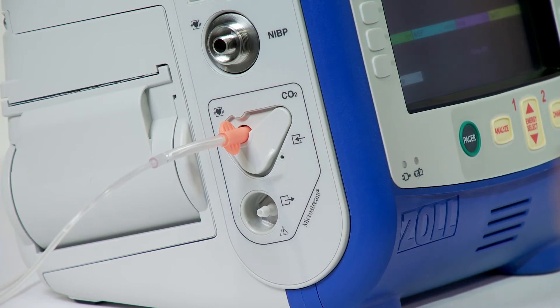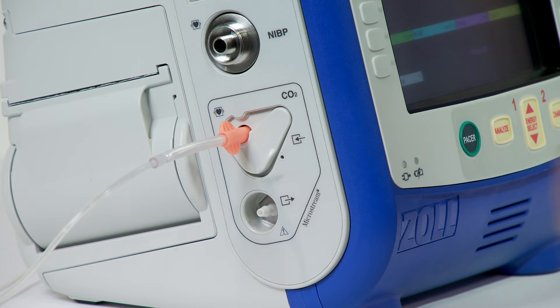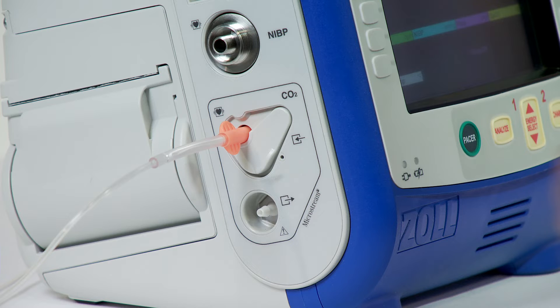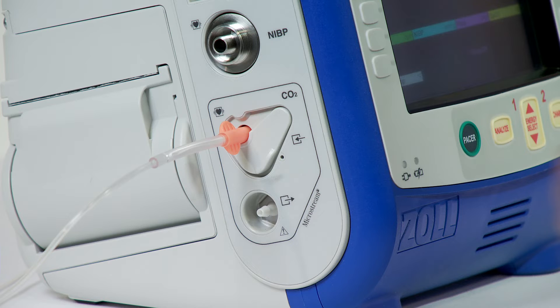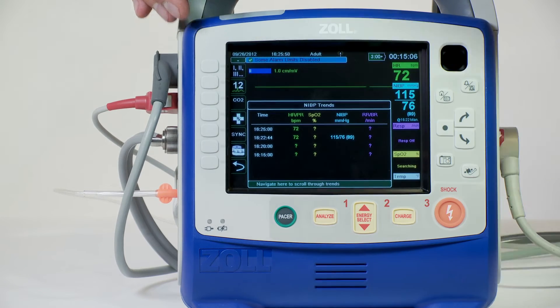The filter line set is intended for the CO2 monitoring of intubated patients. Place the airway adapter at the proximal end of the airway circuit between the elbow and the ventilator circuit Y. Do not place the airway adapter between the endotracheal tube and the elbow, as this may allow patient secretions to accumulate in the adapter.